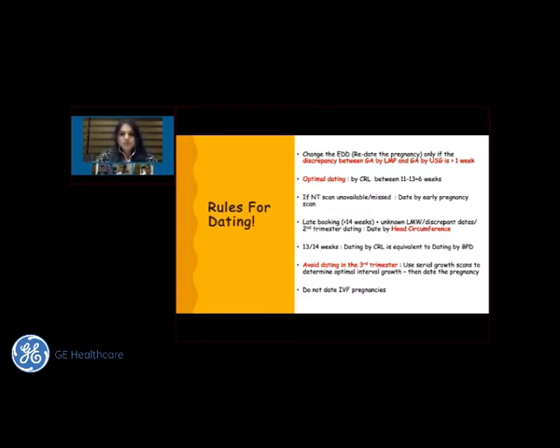I measure the weight of the baby. I take AFI and Dopplers. I call her back in 2 weeks. And what I actually see is the interval growth between today's scan and the weight of the baby after 2 weeks. If it is maintained on the same curve, then I would presume and date her with the head circumference.